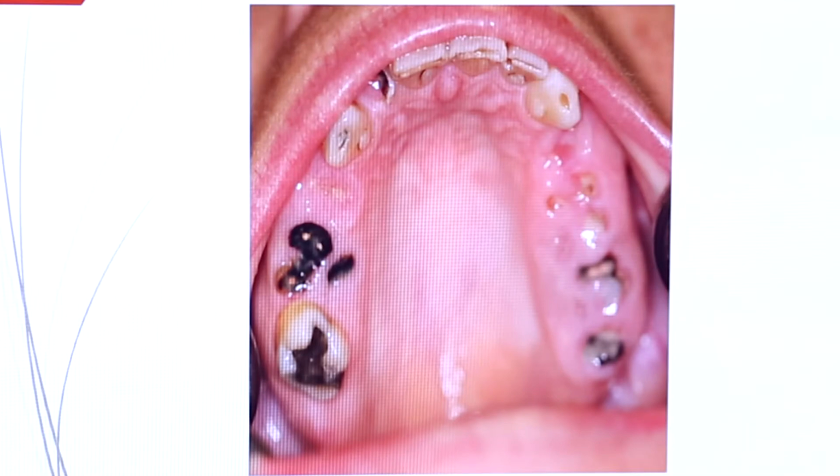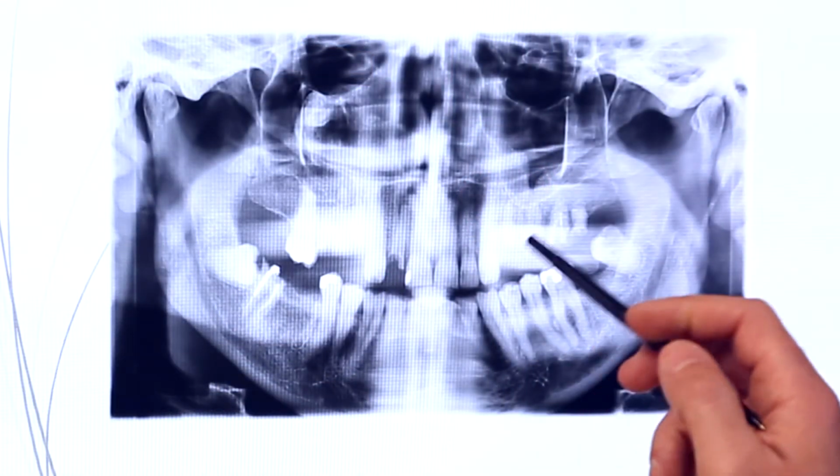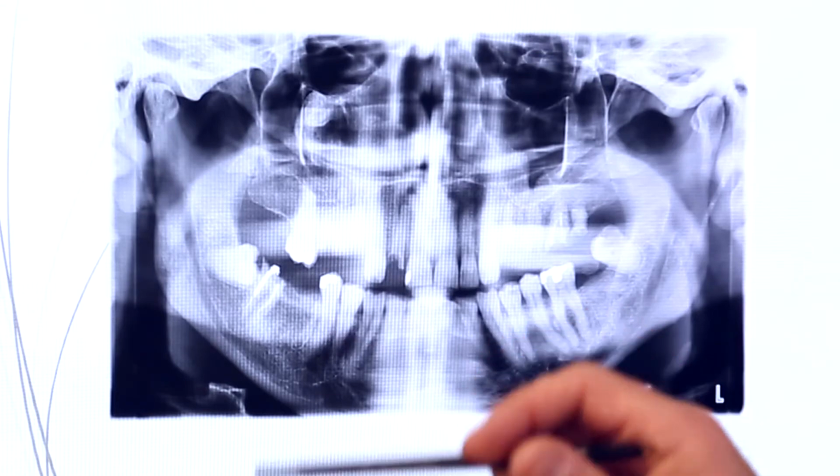This is a view of the teeth from the top, and you can see that there are a lot of retained root tips, which are pretty much non-salvageable at this point. And the teeth that she has remaining, they have decay, and at this point, trying to pour more financial resources into trying to restore these teeth would not be an advisable approach. On the X-ray, again, we can see that there are multiple retained root tips present, and the rest of the teeth are not functional for the most part.